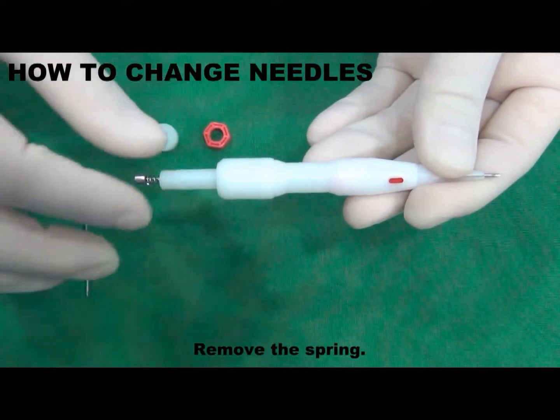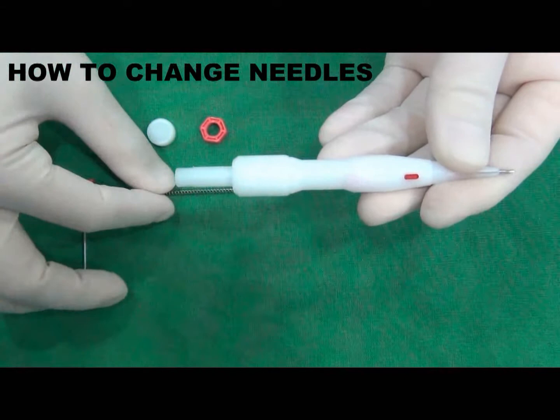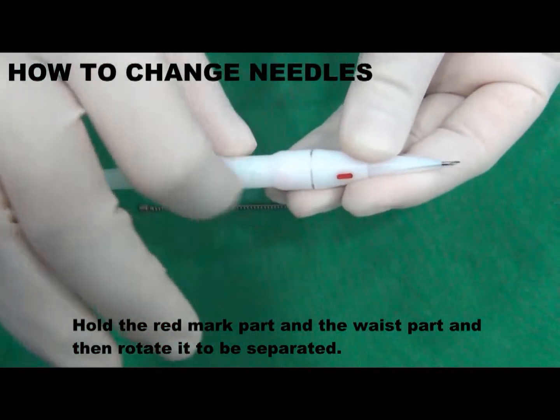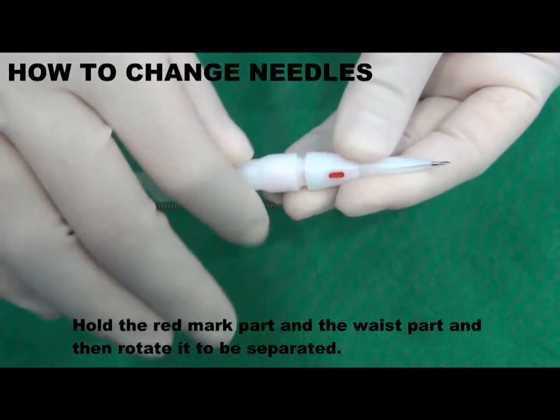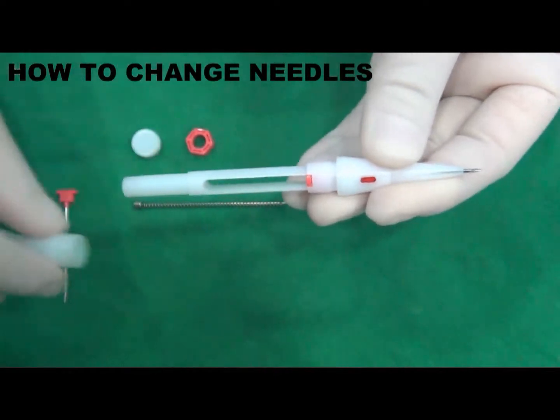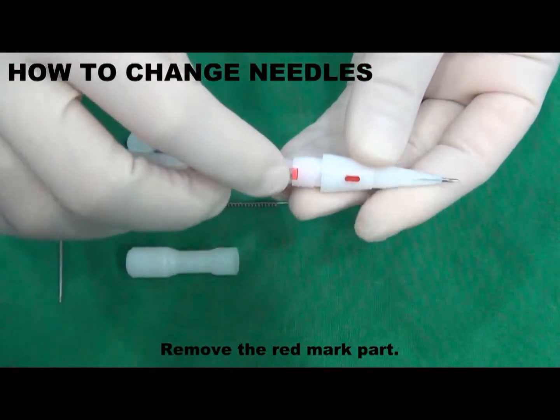Remove the spring. Hold the red marked part and the waist part, and then rotate it to be separated. Remove the red marked part.